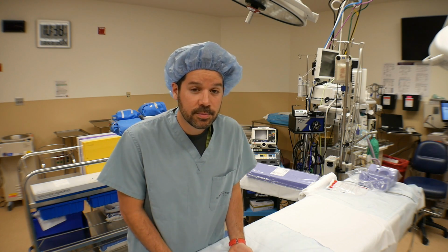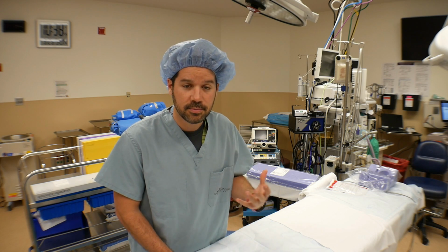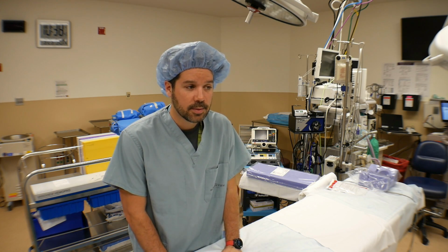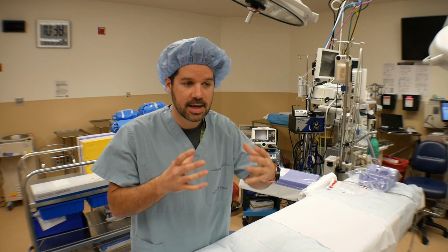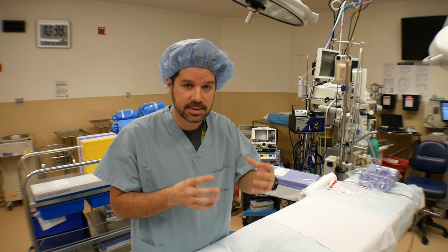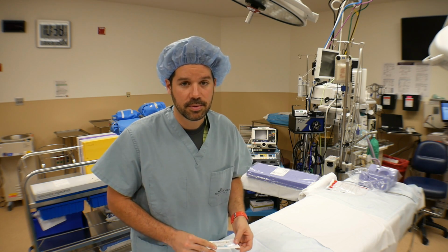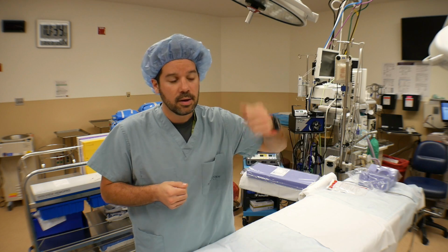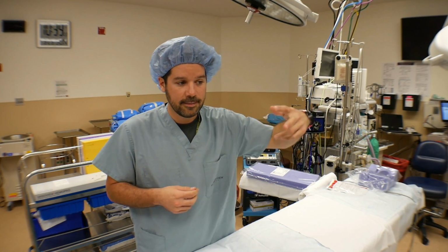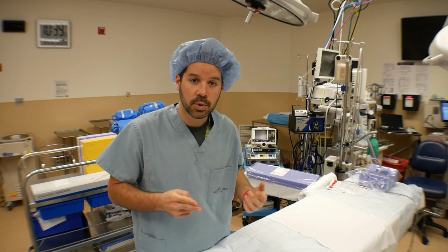Every now and then when you do a biopsy, especially in breast surgery, I see it a lot, to help clarify the exact location of the biopsy itself, they'll put a couple of silk stitches in the tissue sample. They may throw one medial and one superior, and they'll say, cut the superior one long, cut the medial one short.